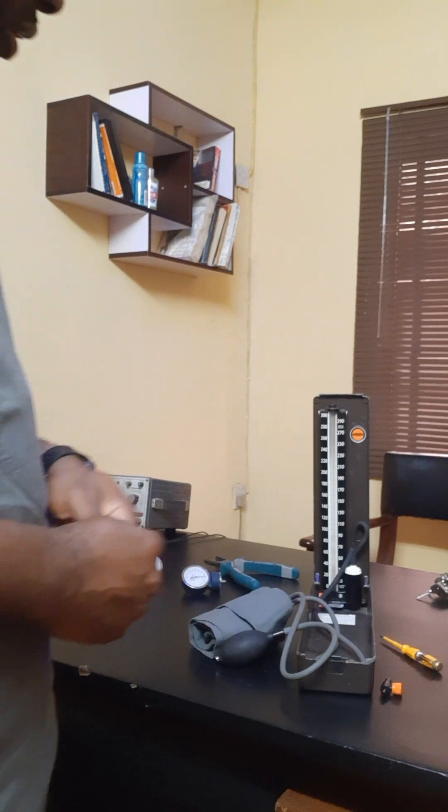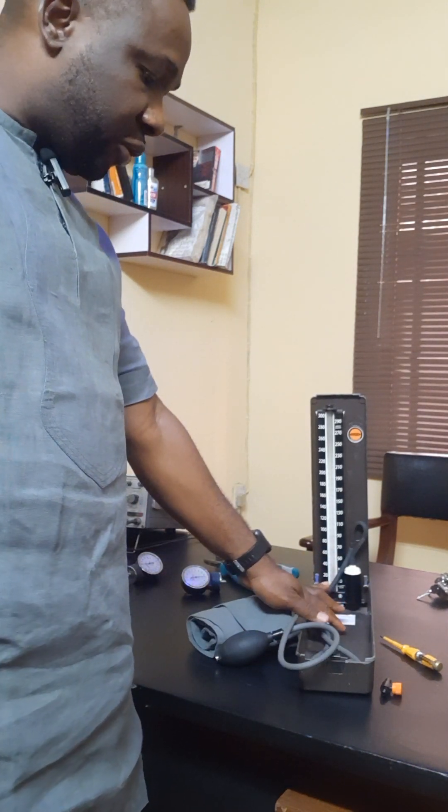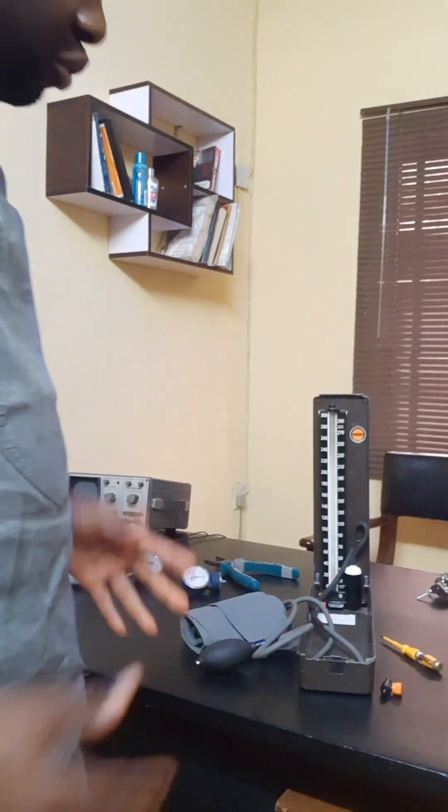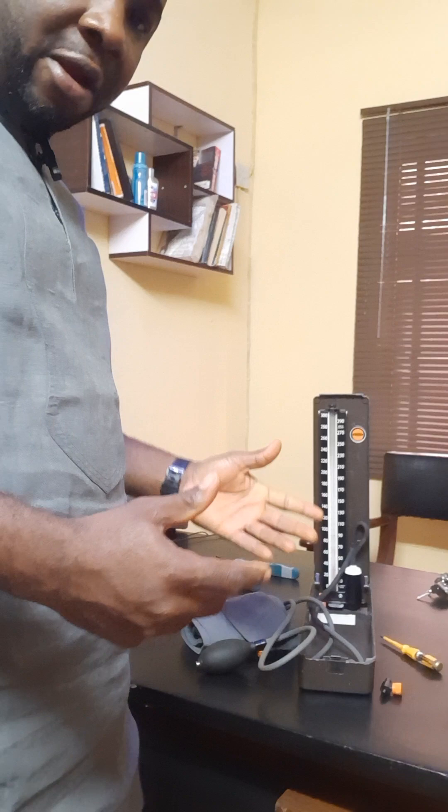So we'll be looking at processes of diagnosing the faults. I would like to show us the parts of this very apparatus.